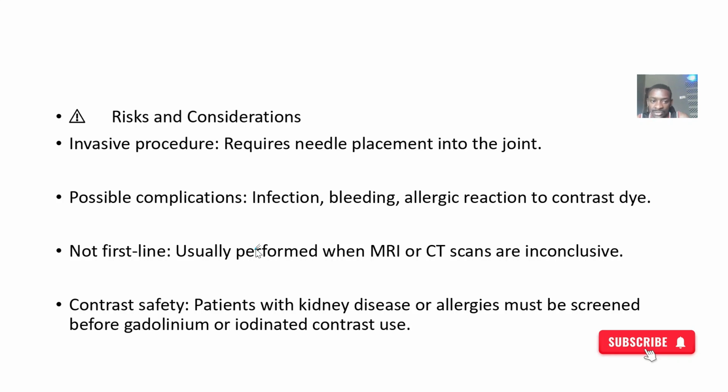So risks and considerations: it is actually an invasive procedure, so you have to be careful. Possible complications could include infections, bleeding, and allergic reactions. Okay. So it's usually performed when MRI or CT scans are inconclusive. It's not usually a first line procedure.